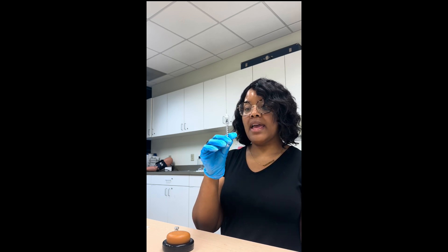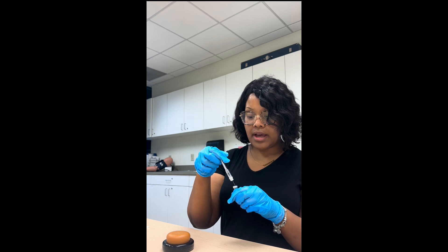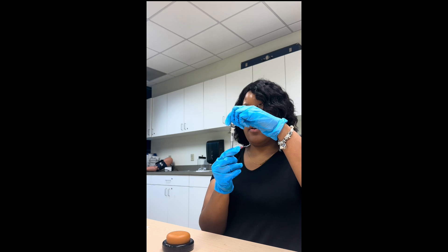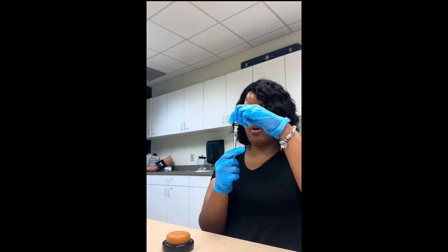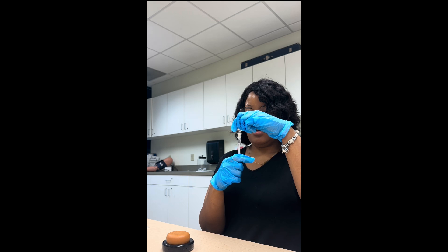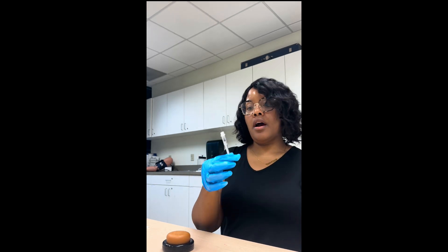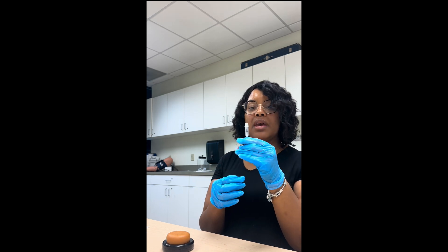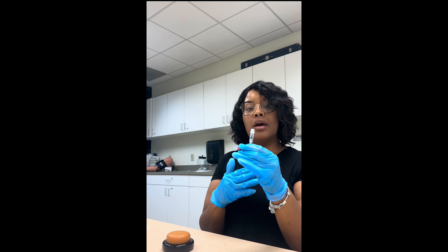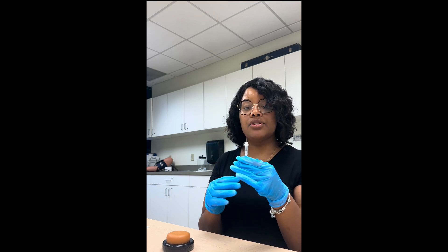I've drawn up my air and I'm going to insert it into my vial, press it down, flip it over, and draw up 0.1 ml. I have 0.1 ml. I'm also going to inspect the needle, making sure it's intact and hasn't gotten bent. If my needle did get bent, I would have to start over.